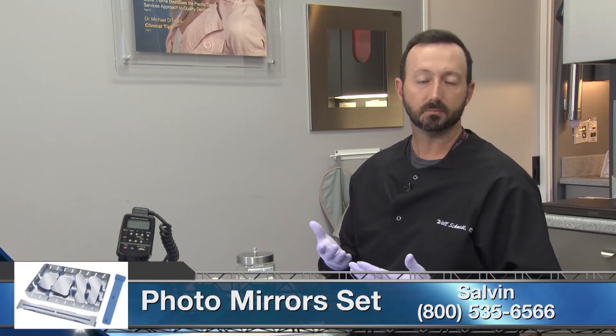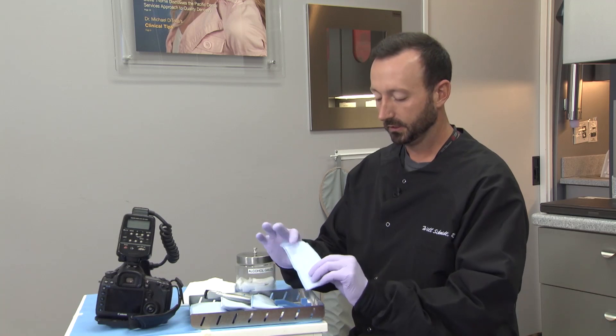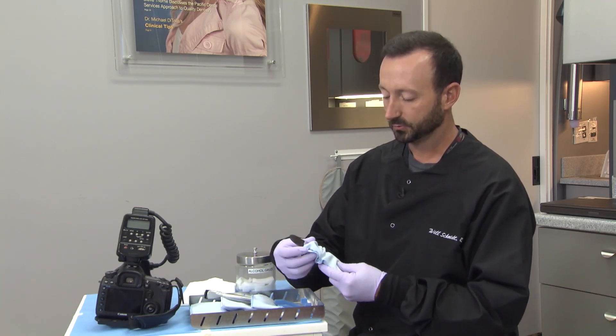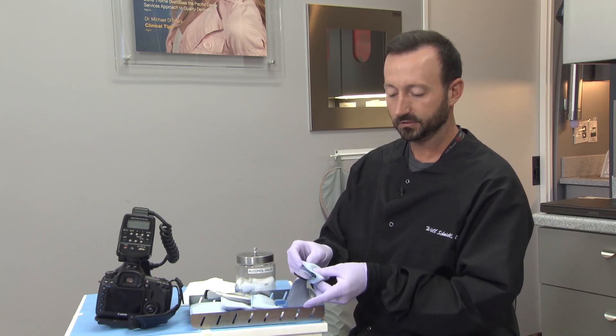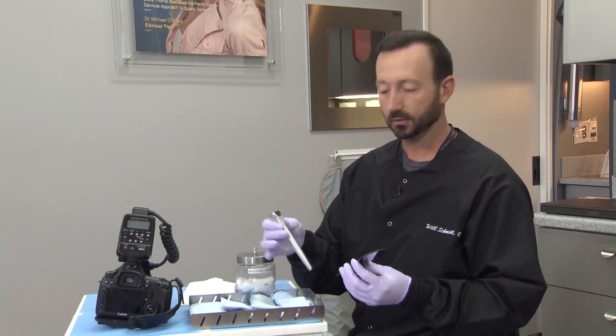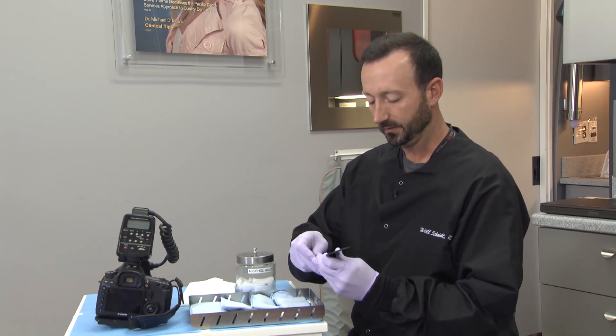I always make sure I use a nice mirror set and keep my mirrors protected at all times, so I have these little soft mirror bags that I keep them in and always wear gloves. You can use these to clean your mirrors off, and I also like to use a mirror holder so that any shots I take I don't actually have to put my fingerprints on them.